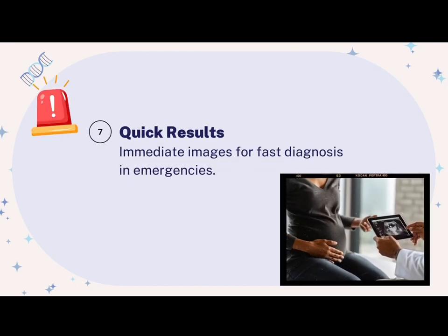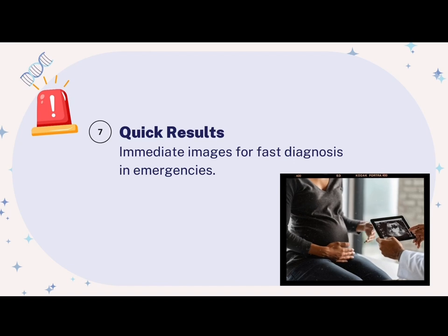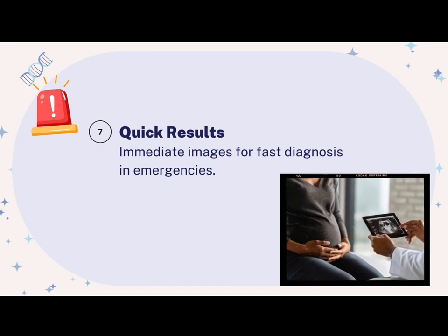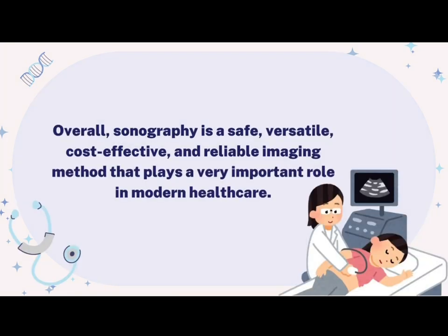Lastly, it provides quick results. The image appears immediately on the screen, allowing doctors to make fast and accurate diagnoses. This is especially useful in emergency situations where rapid decision-making is critical for patient care. Overall, sonography is a safe, versatile, cost-effective and reliable imaging method that plays a very important role in modern healthcare.